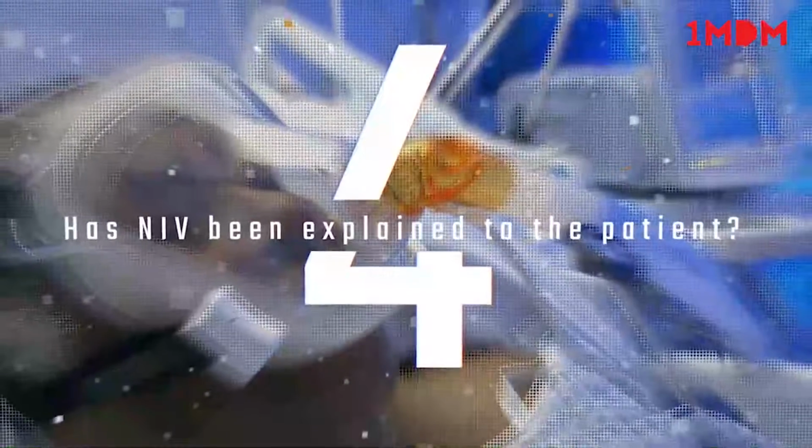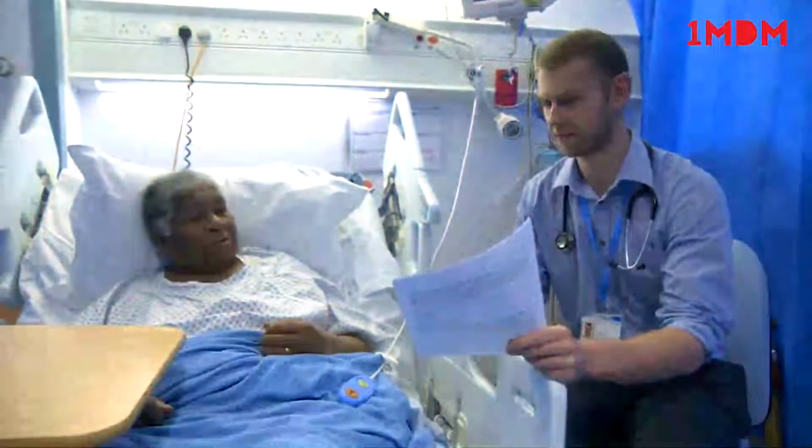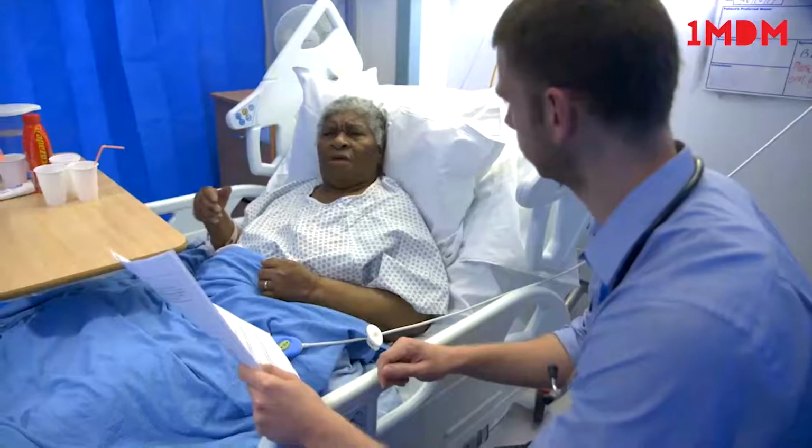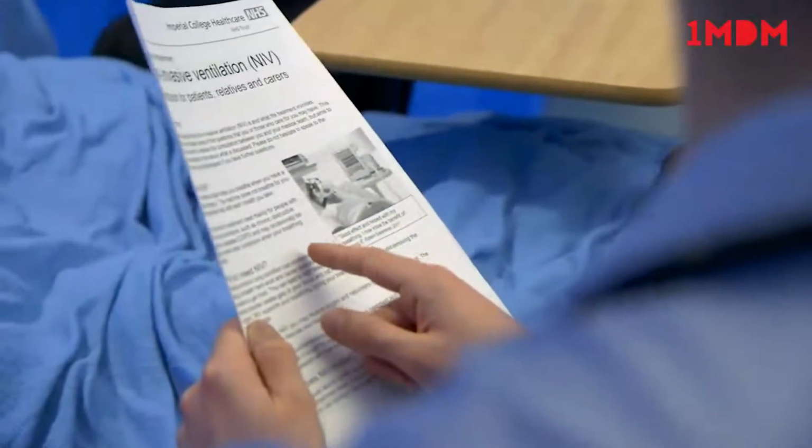Next, has NIV been explained to the patient and/or their next of kin? Non-invasive ventilation can be scary and uncomfortable for patients. It is therefore essential that we provide careful explanation on the process of what NIV involves and ensure we have consent to continue. There is written literature available. However, in the acute situation, it may be more appropriate to provide a careful verbal explanation.